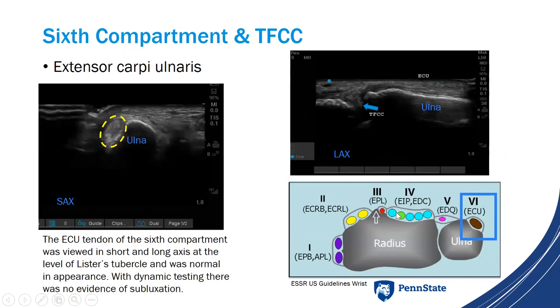Moving on, we evaluate the sixth compartment — the extensor carpi ulnaris tendon — in short axis along the ulna. You can also test for ECU subluxation dynamically, especially if the patient is symptomatic on that side. This patient was not symptomatic there, but we still tested. In my report: 'The ECU tendon of the sixth compartment was viewed in short and long axis — normal in appearance — and with dynamic testing there was no evidence of subluxation.'